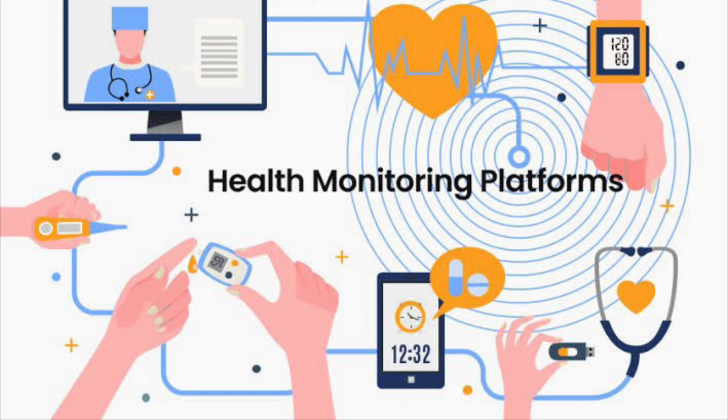Step 5 is to train patients and clinicians. But the problem with this wearable technology is one thing, it is device dependent. So if the device is not functioning properly, naturally the data that is generated can create problems. It may not be correct.